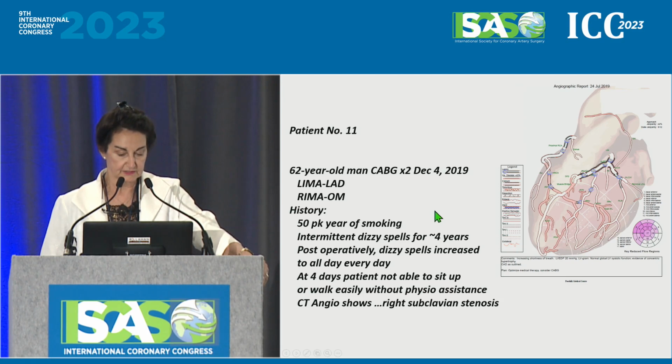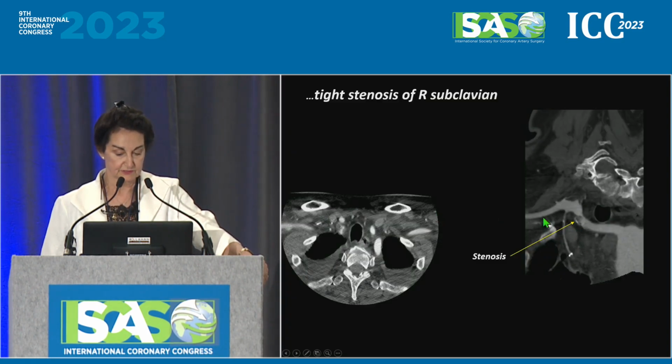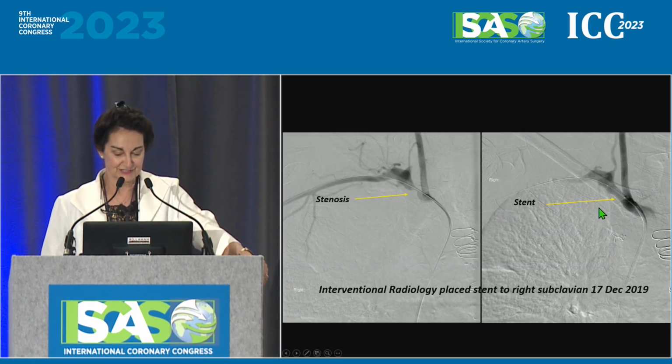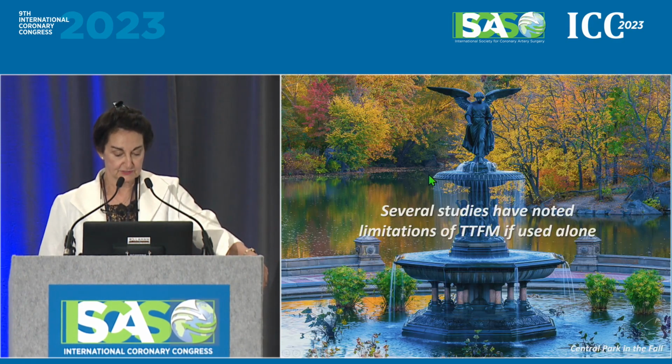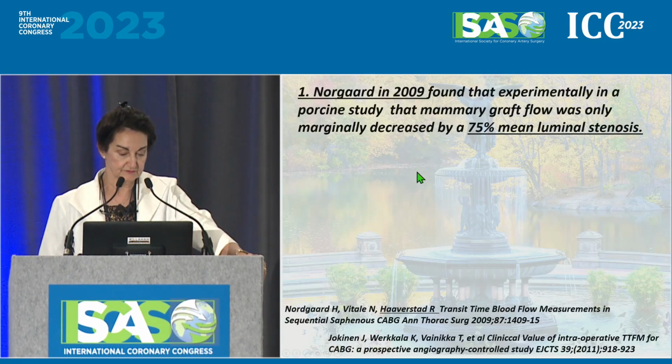We did a CAT scan, and it showed right subclavian stenosis. And there's the stent. After the stent placement, the patient immediately felt better, completely better, while on the angio table, got up and walked home. I'm just kidding. So several studies have indicated limitations of TTFM.